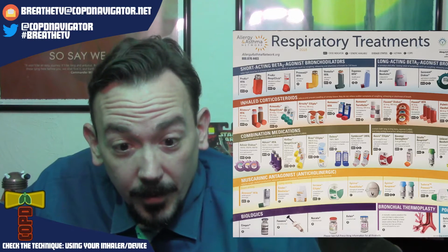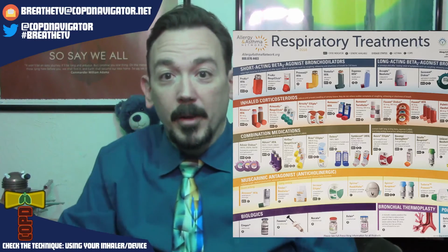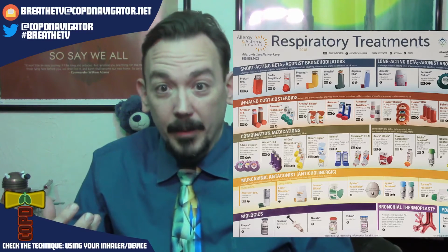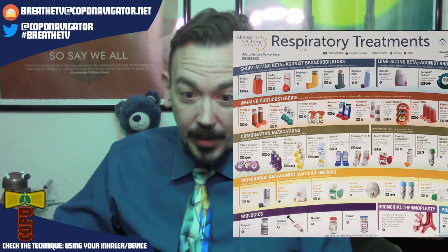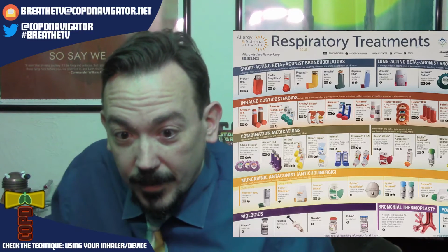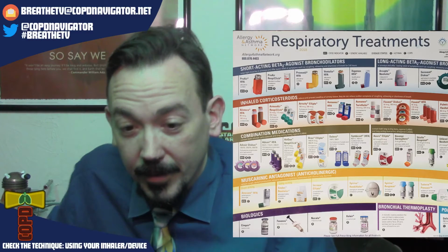The first one there, the Neohaler, has a single dose. Many people might be familiar with the Spiriva Handihaler. Similar concept. You get a blister pack of pills, you pop one out, you put it in the device, you crack it, you do all this stuff, and then you inhale it. Then you see the Ellipta, then you see the Handihaler again. Up a couple rows, we start seeing the Diskus, which is a little bit old school. If you've ever had Advair, you see the Diskus.